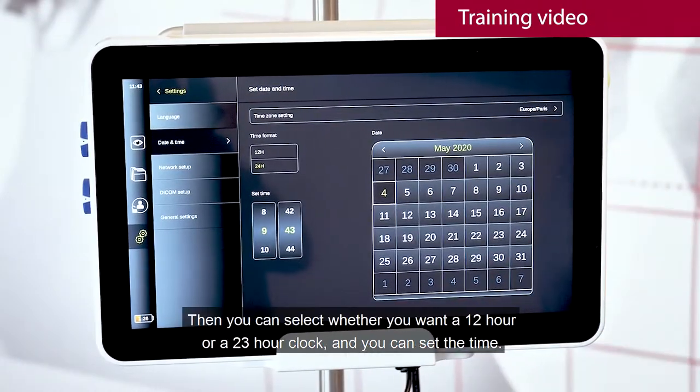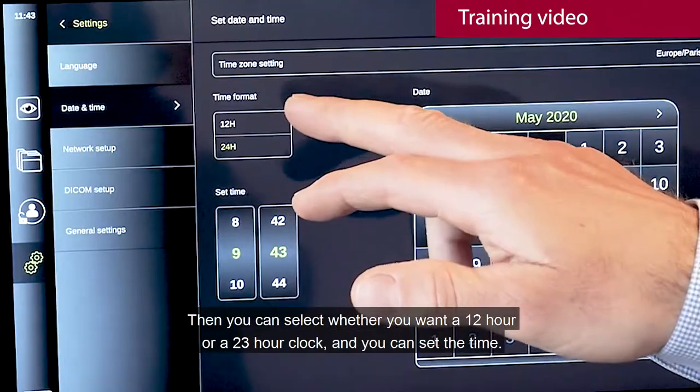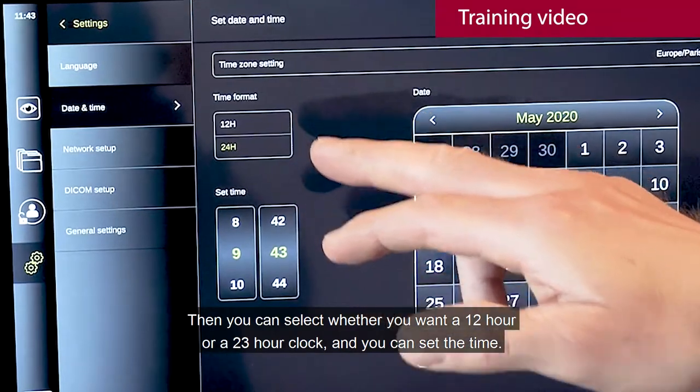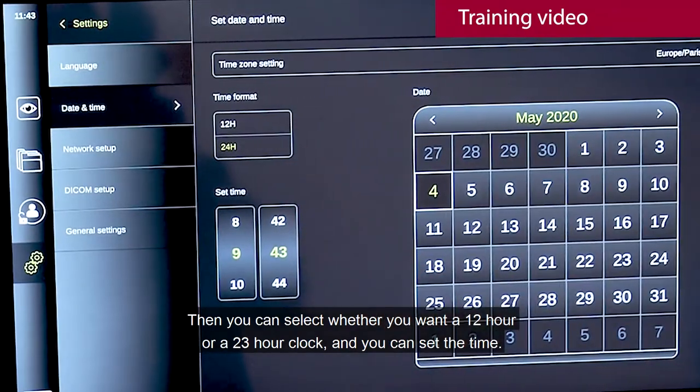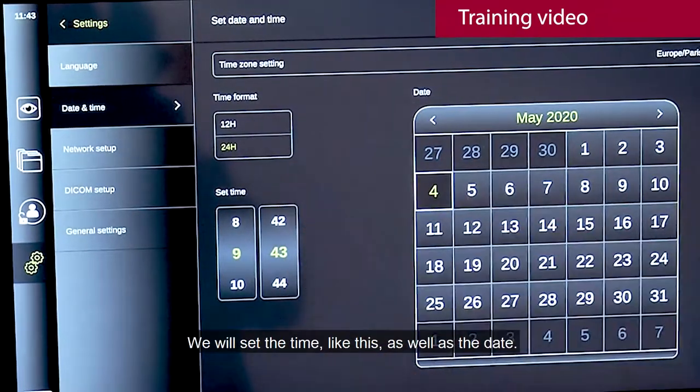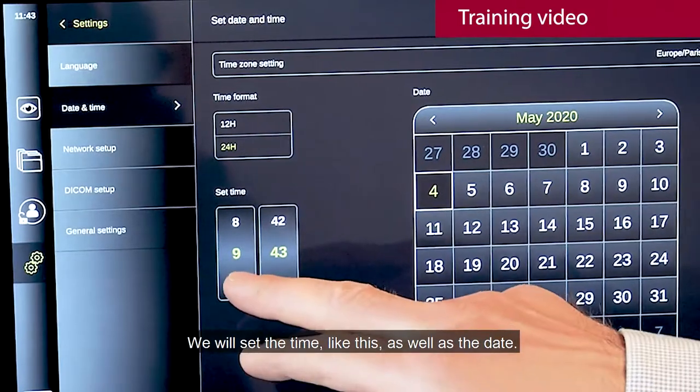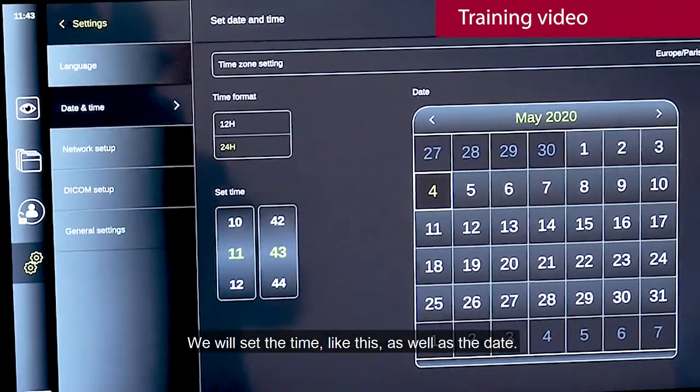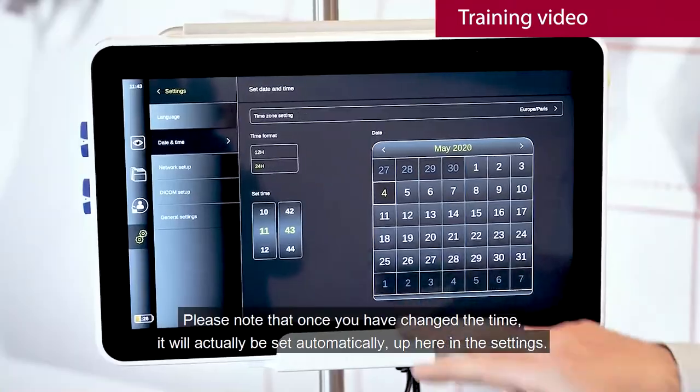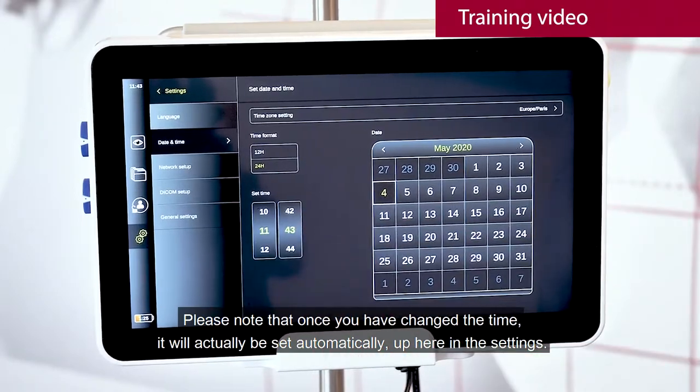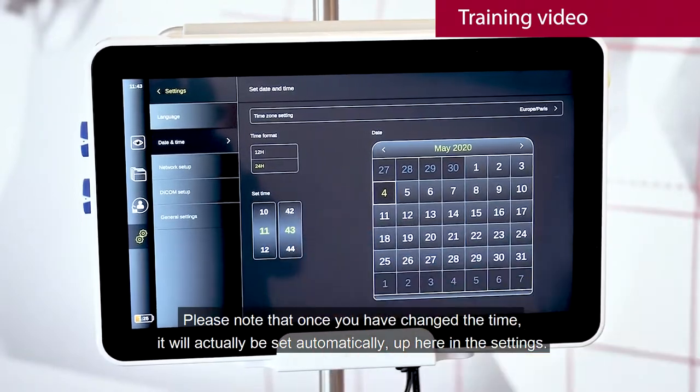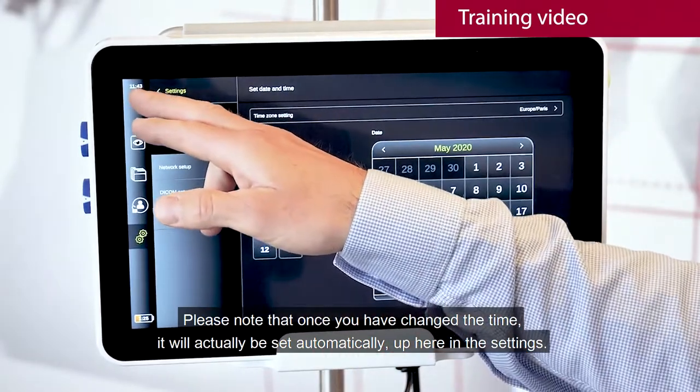Then you can select whether you want a 12-hour or 24-hour clock, and you can set the time. We will set the time like this, as well as the date. Please note that once you have changed the time, it will actually set automatically up here in the settings.